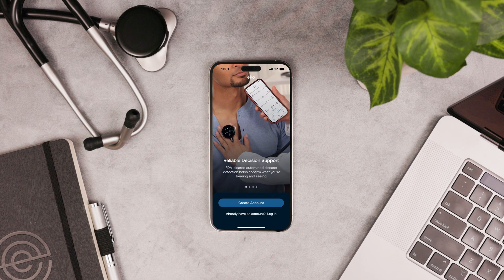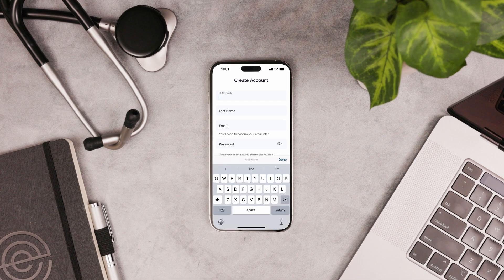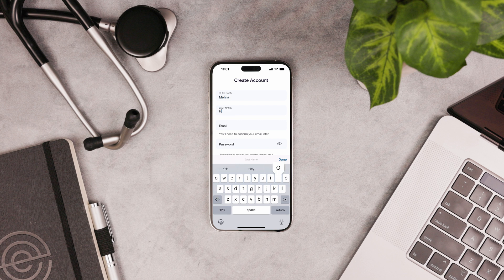Next, create an Eko account in the app. At the bottom of the screen, tap Create Account. Enter your information. Look for a confirmation email in your inbox — you'll need to confirm your account.